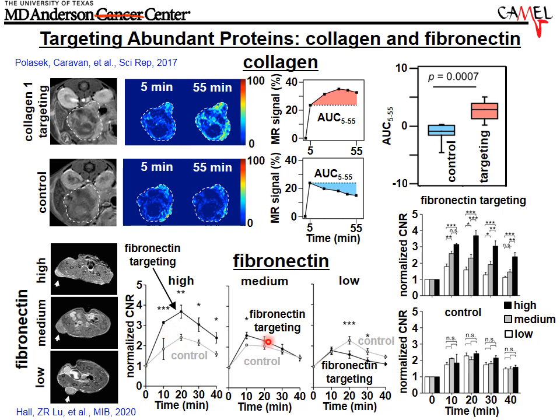And so these studies are challenging to perform because you have to get the timing right, the amount of agent has to be set correctly, and of course you need a model that has high fibronectin and low fibronectin so you can compare the two. If you only had the low fibronectin model and you saw these white bars, well, it would be more challenging to know if you're detecting fibronectin or not. This is a differential measurement between the tumor models.